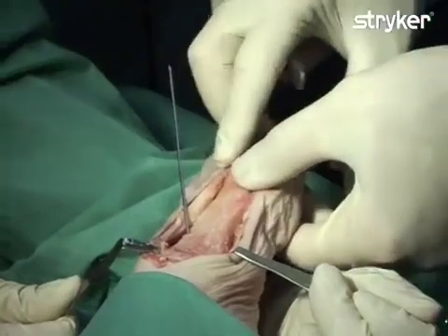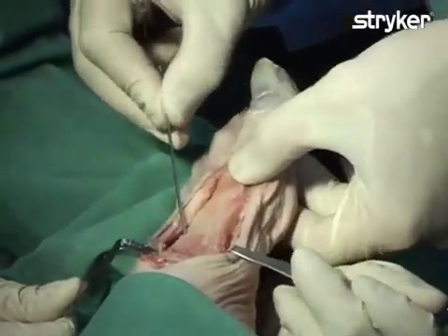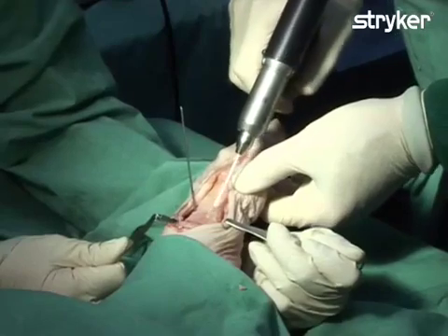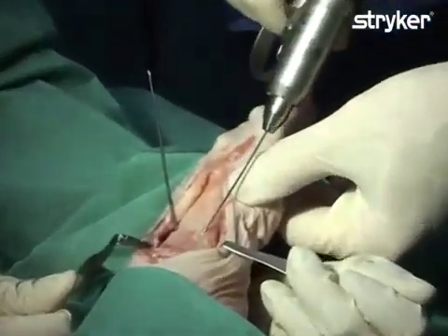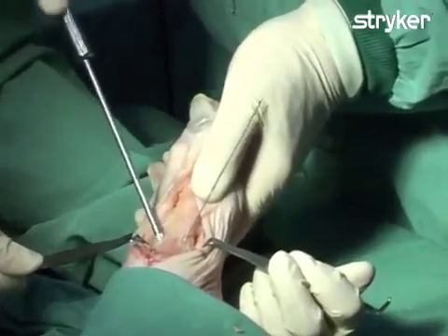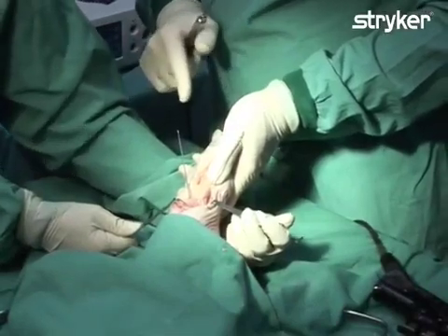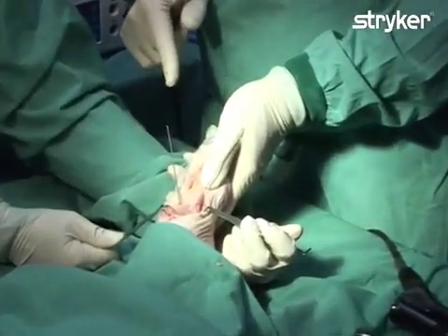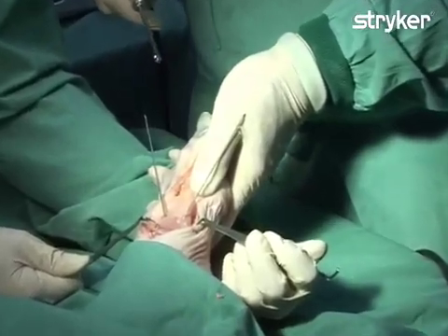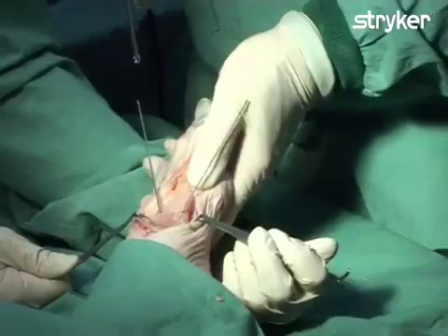The K-wire will be inserted in the direction indicated, representing the desired final position of the ASSIS III screw. In order to prevent intraoperative rotation, a second K-wire can be inserted at an angle that crosses the initial K-wire. Counter-sinking is then performed using the cannulated ASSIS III countersink over the K-wire. Screw measurement is performed by sliding a direct depth measuring gauge over the inserted K-wire. In this case, a 36 mm long screw will be used.